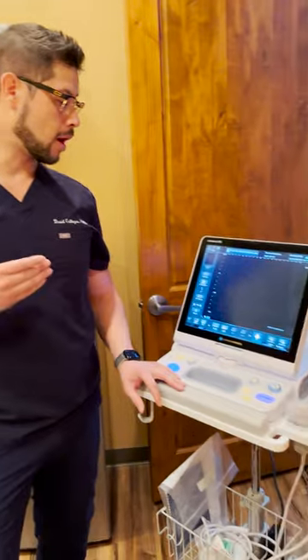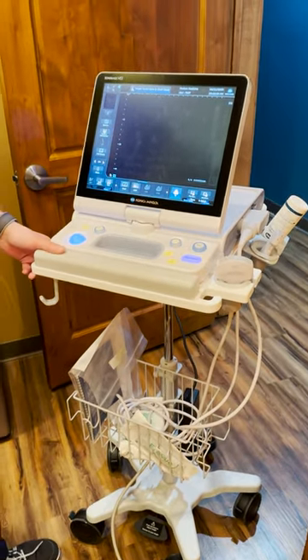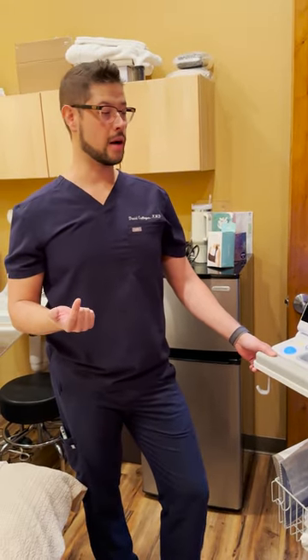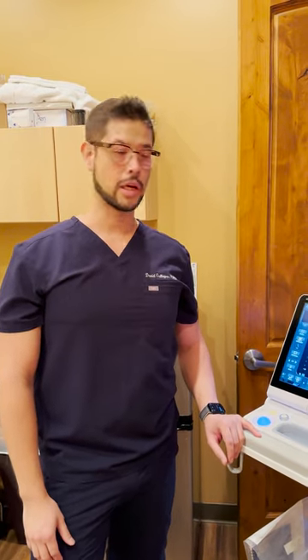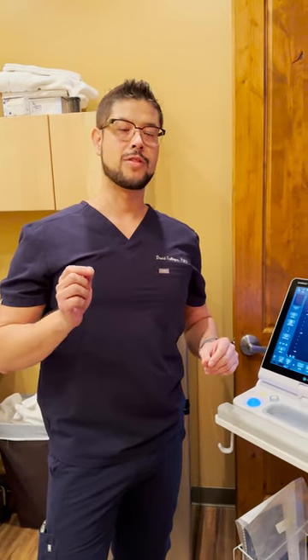With that being said, we're going to be incorporating our new unit. It's a brand new Konica ultrasound device — one of the state-of-the-art machines we use for MSK or musculoskeletal imaging. It's very robust compared to the unit we had prior. The other unit was awesome as well, but it didn't have as much of the fine-tuning capabilities that this unit has.